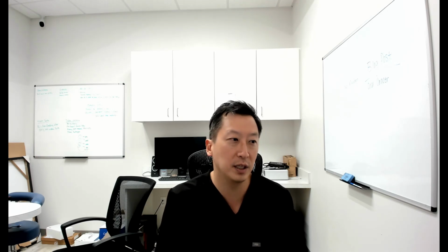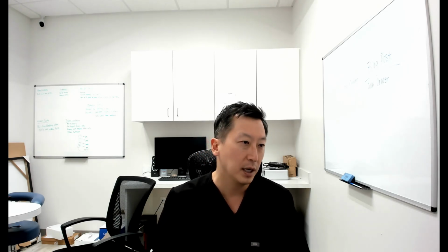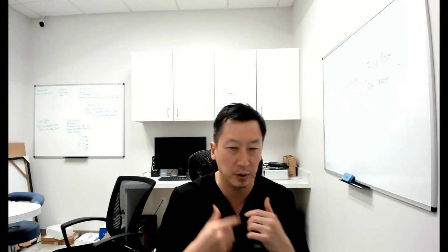We did it the old traditional way with something called the chair side conversion. Long story short, it was a pain in the butt. Because you're taking a denture that you converted into an all-on-four prosthesis, it's essentially like patchwork. The prosthesis, a tooth might break, the prosthesis might break in half during that healing period over the next 5-6 months. So we got away from that.